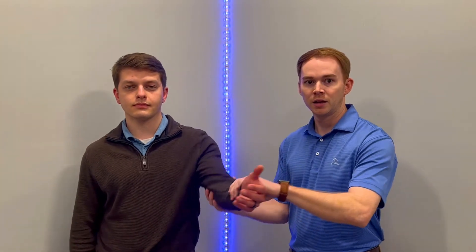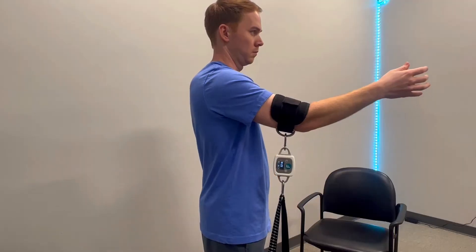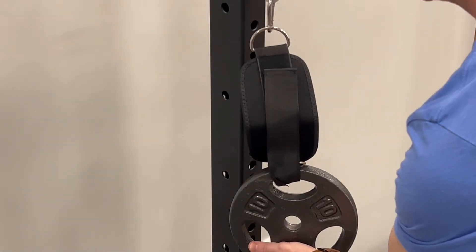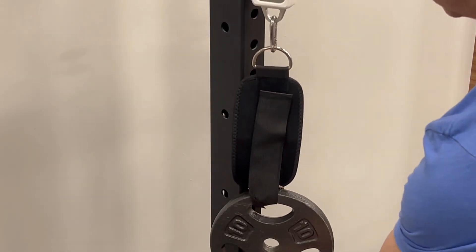Let's take shoulder flexion as an example. For manual muscle testing, I would place my hand here and tell the patient, 'Don't let me push you down,' and they would have to resist. Then I try to give my best estimate on what grade out of five I'd give that muscle. Now let's do that same assessment with the Easy Force — and now you have an exact measurement in pounds of what his shoulder is currently capable of performing.